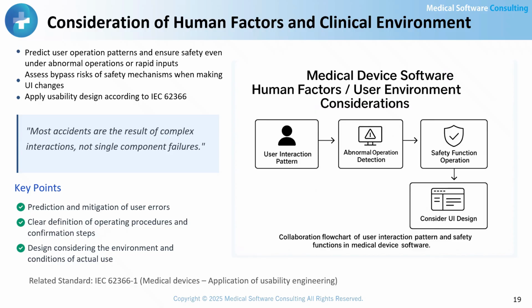In the Therac 25 accidents, the rapid keystroke input of an experienced operator caused inconsistencies in internal variables, leading directly to overdoses. Designs that underestimate the influence of user expertise and operating habits can introduce serious risks. IEC 62366 requires developers to account for the user's working environment and operational characteristics, and to integrate the user interface with safety mechanisms as part of the overall design.